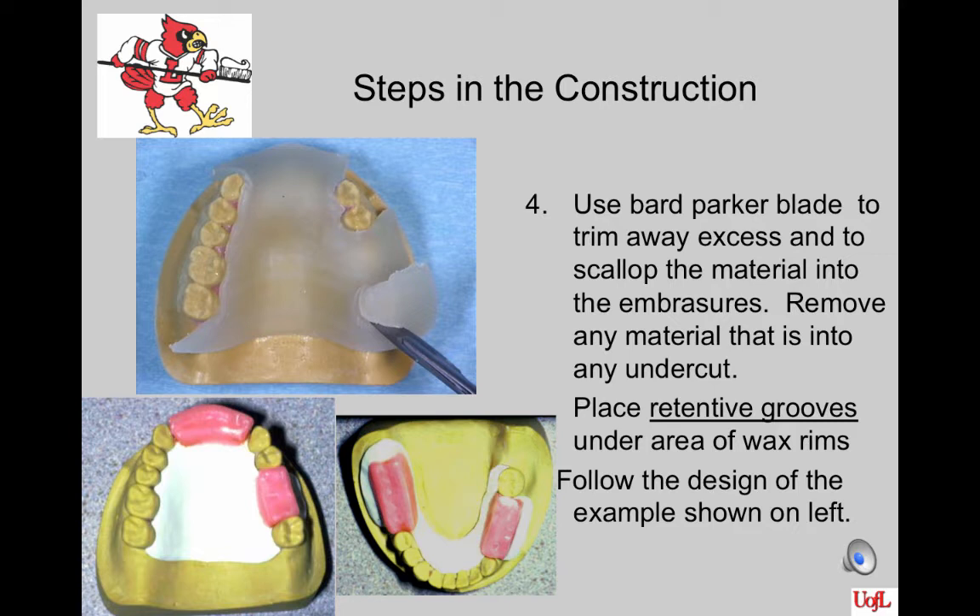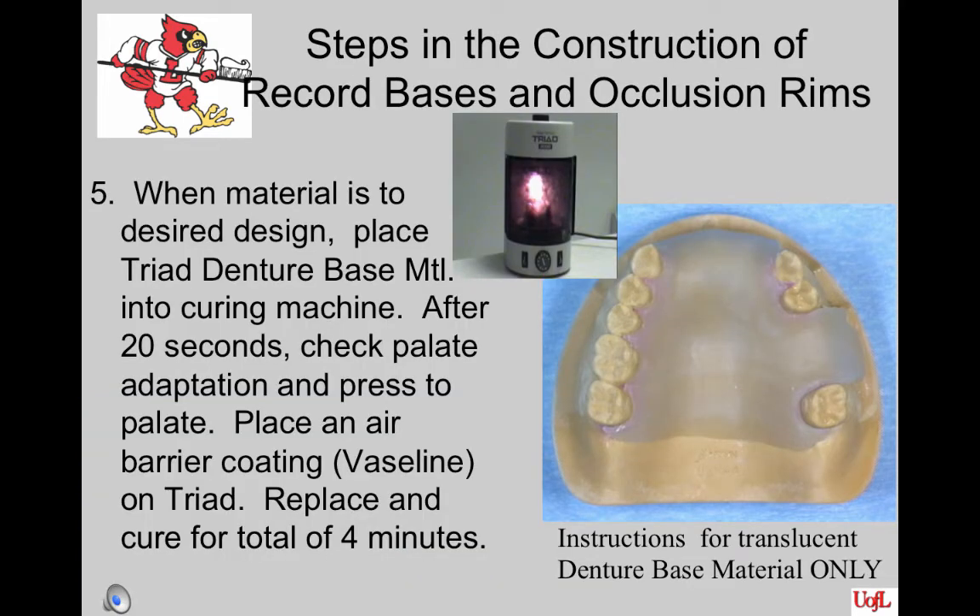When you have adapted it, use a Bard-Parker blade to trim away the excess and to scallop the material into the embrasures. Remove any material that is into an undercut. Place retentive grooves or dents on the areas where the wax rims will be placed — wax does not adhere as well to triad as it does to acrylic resin. Follow the design shown on the bottom left. Triad comes in various colors; the instructions for this procedure are for translucent triad. The curing times for the colored triad are longer.